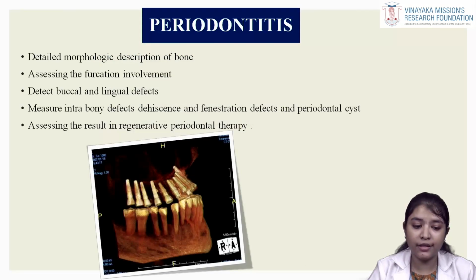In periodontitis, it can be used for morphological description of the bone, assessment of the furcation, if there are intrabony defects or buccal and lingual defects, and even in the assessment of regenerative periodontal therapy.